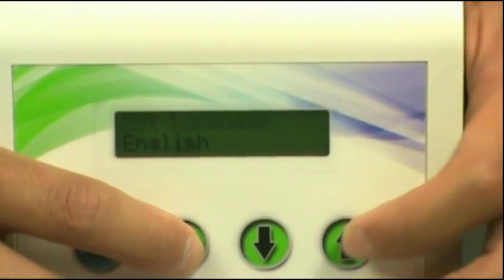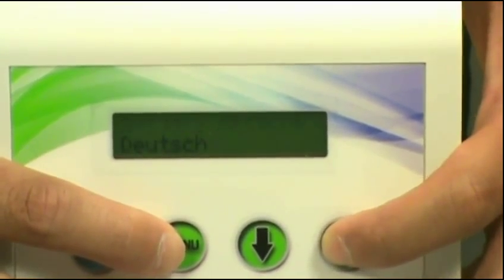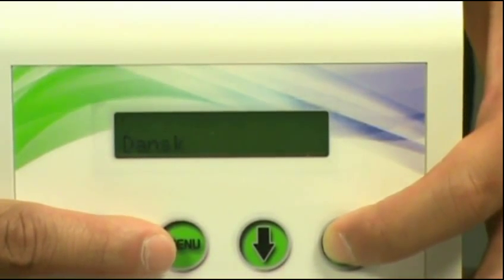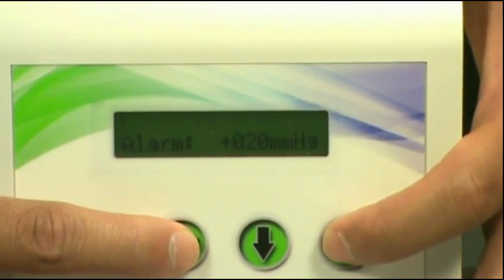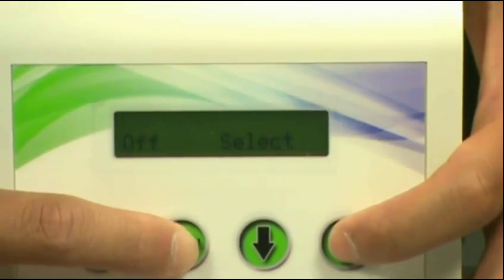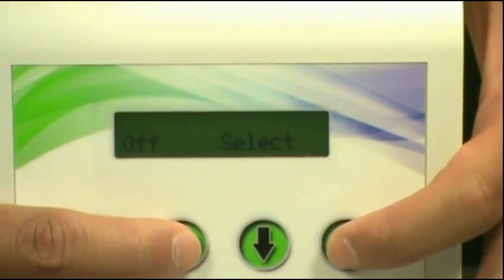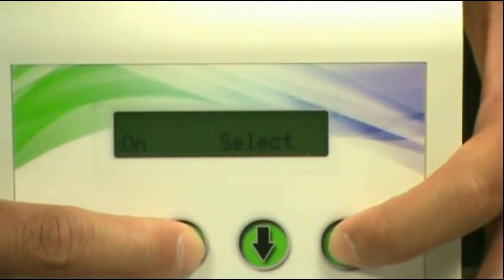First option will be your language option. You can scroll through all the languages by pressing up or down button. We will stick with English at this time. Press the menu button again. It will take you to the pressure tolerance option. Press menu again. It will take you to the intermittent or variable option. Press up or down button to set on and off.